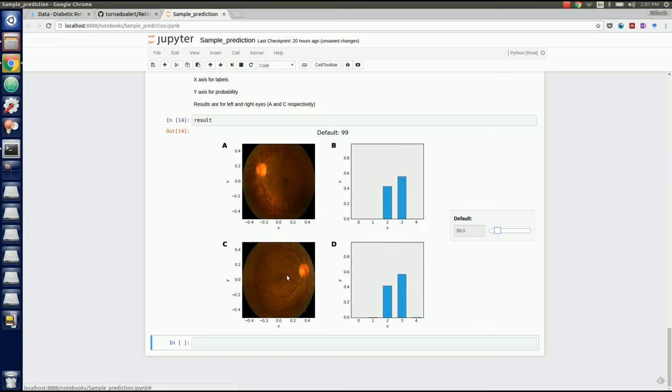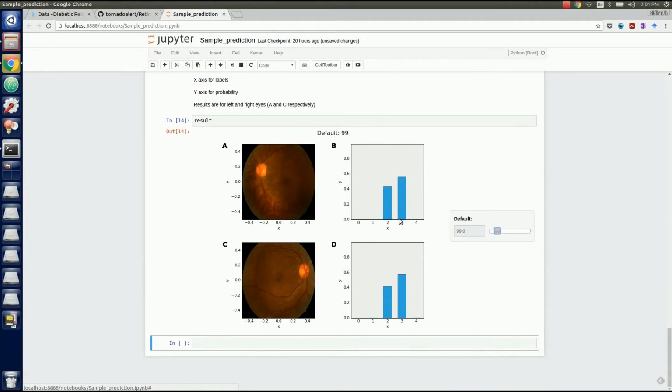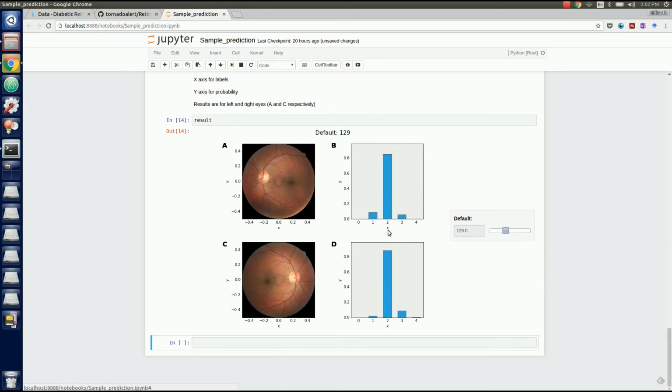Okay, yeah, this looks like severe diabetic retinopathy, and it did classify it as severe diabetic retinopathy, but it kind of has a doubt whether or not it's severe. It's almost 50-50 between moderate and severe, but that can be excused because the lighting conditions aren't that great as well. So the next one, this is moderate diabetic retinopathy, and I think it got it right as well. I think it's labeled moderate.